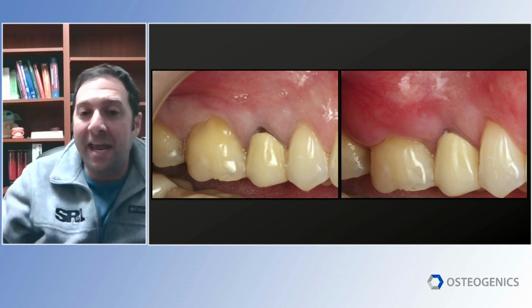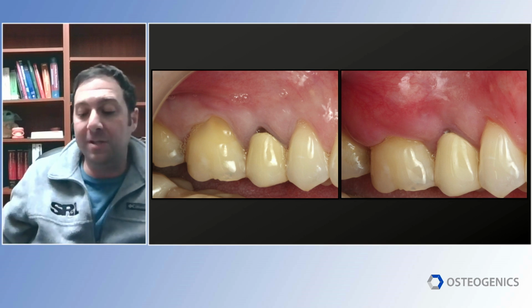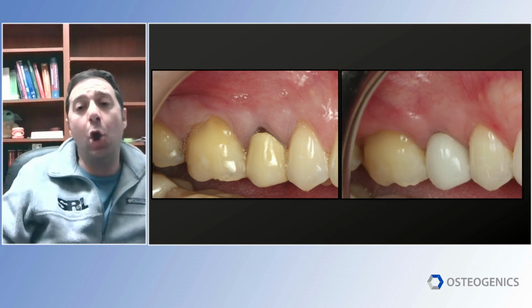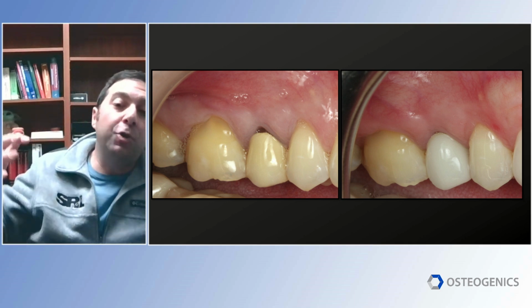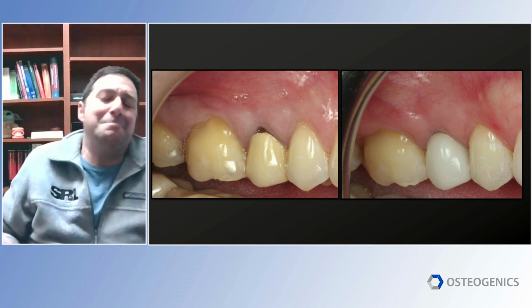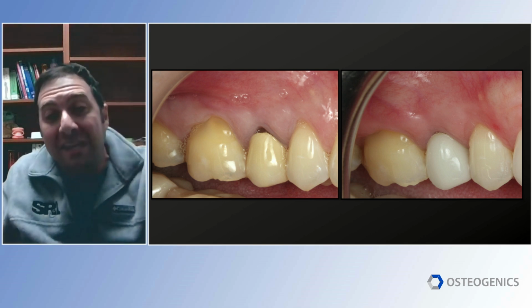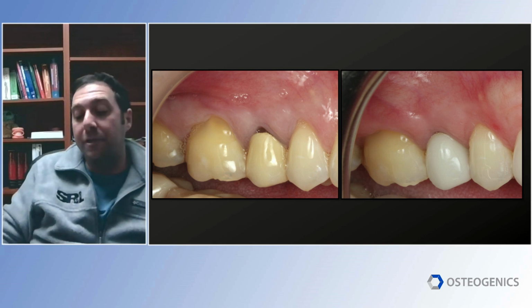The tissue wasn't inflamed. There was no sign of graft exposure, no necrosis. And now long-term, this is over a year. Look at the mesial buccal root. Did we gain keratinized tissue? Maybe, maybe. But we definitely got increases in tissue thickness. You can see that right there, and good stability in root coverage.